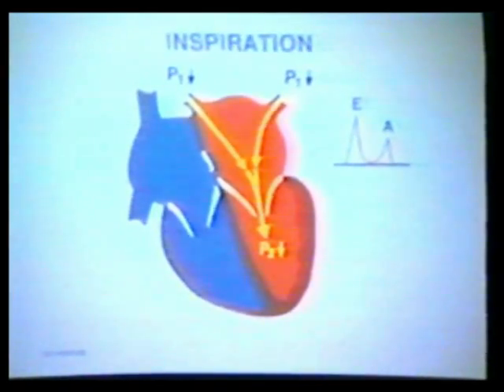In normal individuals, as intrathoracic pressure decreases with inspiration, there is a decrease in the pulmonary venous pressure. There is also a decrease in intrapericardial pressure, which is of approximately the same magnitude. Since this decrease is fully transmitted to the left ventricle, the decrease in LV is equal to the decrease in the pulmonary veins. The effective filling gradient, or driving pressure between the pulmonary veins and left ventricle, therefore shows little change with inspiration.